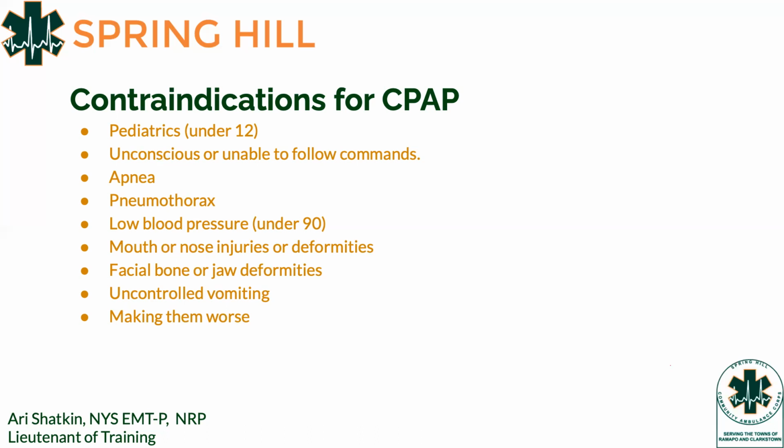And is that good for our negative pressure system? Now creating a pressure that's going to be equal to the outside. It's not. The lung won't expand. It's going to fill with air, and that air, because it has to take up space, much like a balloon, is going to compress on the lungs and the heart. And so CPAP will just continuously push air into that. That's not going to work. So that's why we usually say when you're dealing with COPDers, because they are prone to these pulmonary blebs, to use it with caution. Make sure you listen to their lung sounds. Make sure that they're not having absent lung sounds on one side, which is going to be your very telltale sign of a pneumothorax. And if that's the case, remove the CPAP.